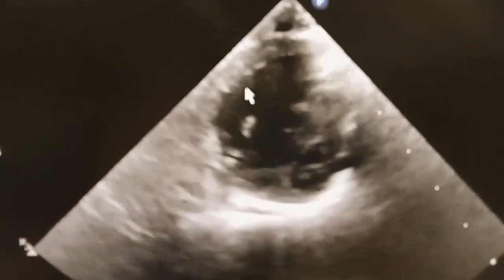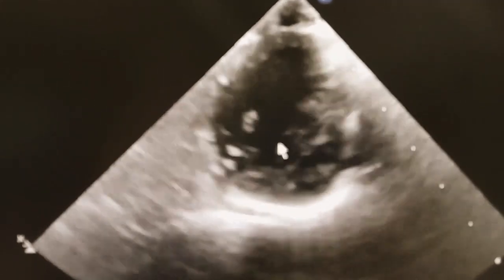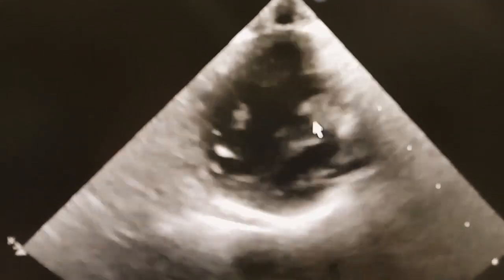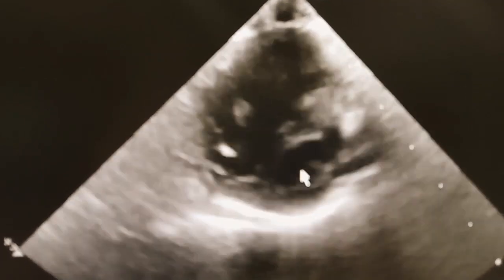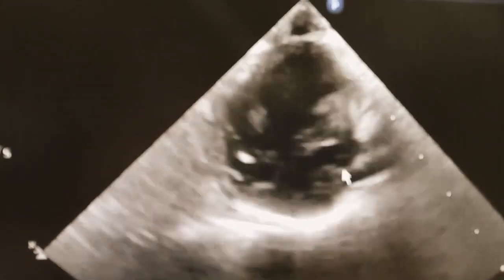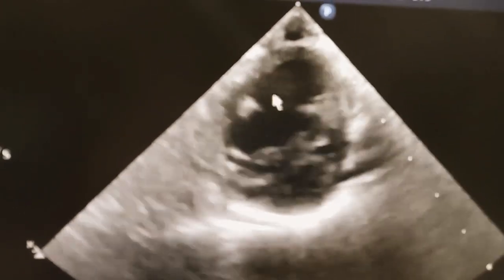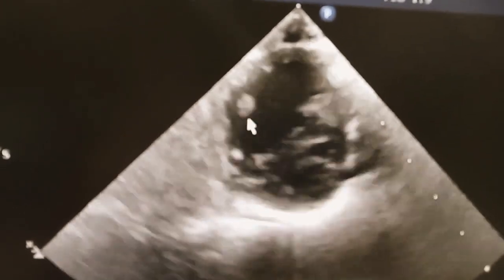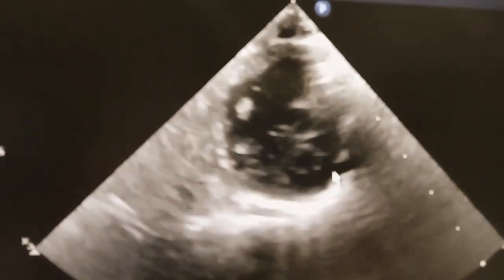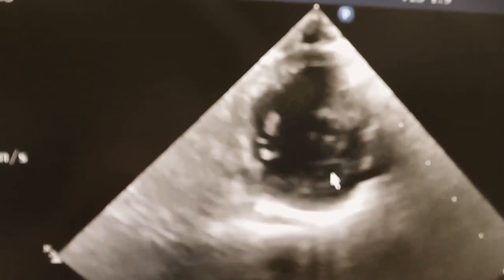Here you can see the right ventricle is very big. This is the interventricular septum. And this is the small left ventricle — you can see it contracting. Big right ventricle, interventricular septum, and small left ventricle — this is seen classically in hypoplastic left heart syndrome.